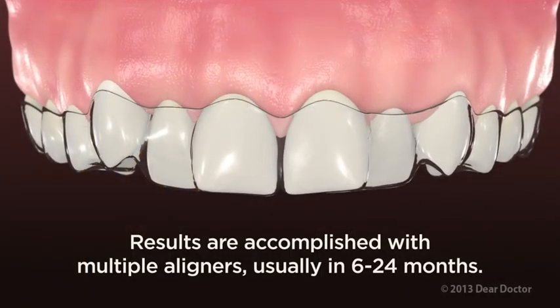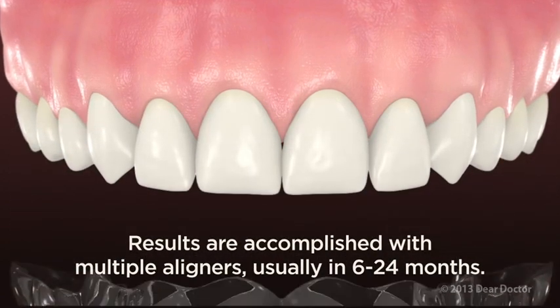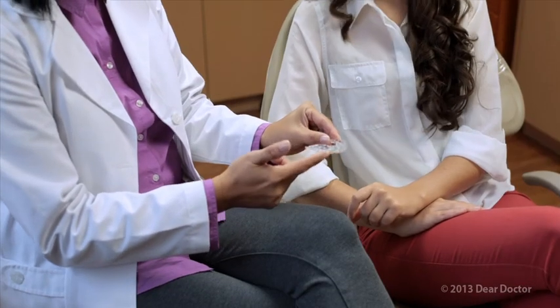So how can such a thin, removable tray get the job done? Believe it or not, the same way as traditional braces — by applying carefully controlled, gentle forces to the teeth. Here's how it works.